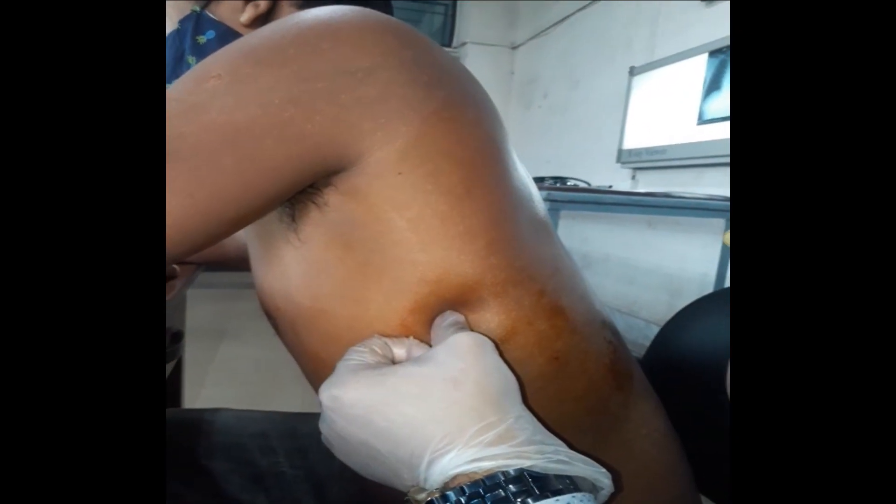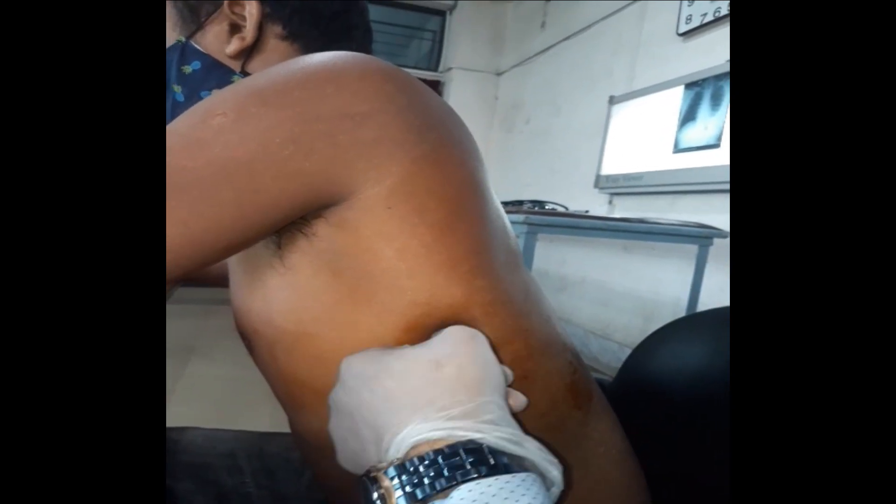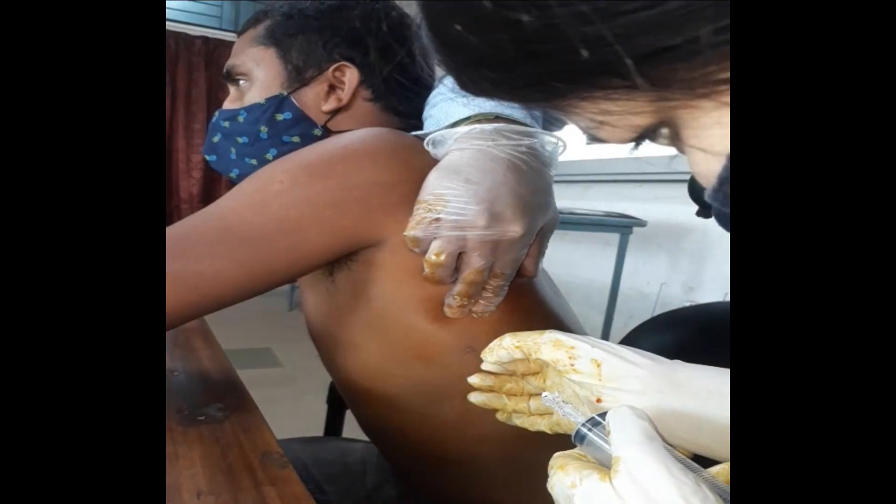Now we should palpate the intercostal space to find the upper border of the lower rib. After finding the upper border, we introduce the needle just above the upper border of the lower rib. Let's introduce the needle.